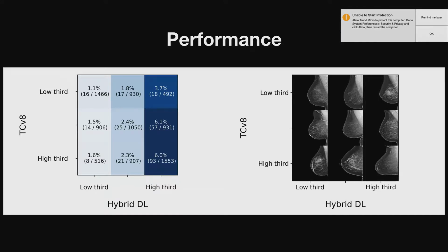Great. A clear trend you see is that, for example, if Cusick calls you high risk but we call it low, that is a lower incidence than if we call it medium and they call it low. You see this straight column-wise pattern showing that discrimination truly does follow the deep learning model and not the classical approach. And looking at the random images selected where we disagree, it supports the notion that it's not just that the column is the densest-looking breast, and that there's something more subtle being picked up that's actually indicative of breast cancer risk.